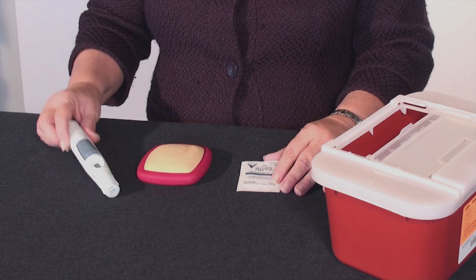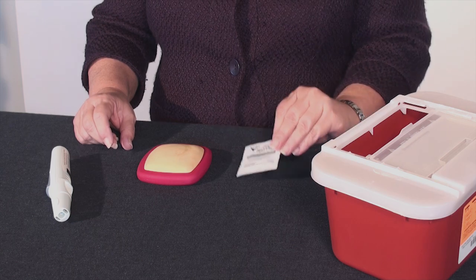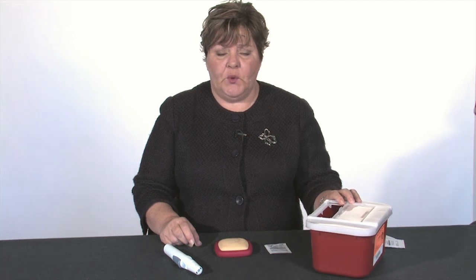How do we inject Sympony? First you're going to gather your supplies. You will need your syringe, which you will have taken out of the refrigerator about a half an hour before you're ready to inject it. You'll need an alcohol wipe or a cotton ball with a bottle of rubbing alcohol, and you'll need a puncture-proof container. It can be a sharps container like this, or a puncture-proof bottle such as a milk jug or a laundry detergent bottle.